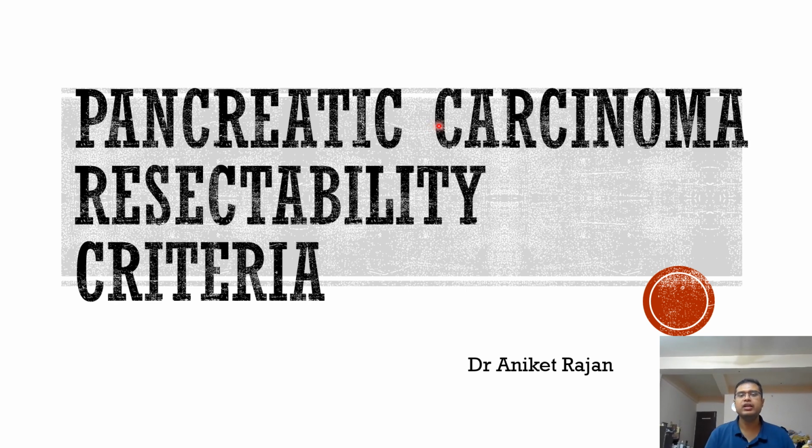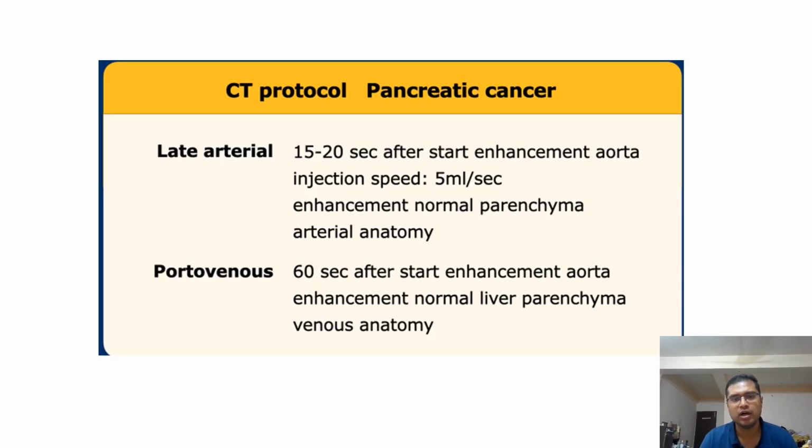So the resectability is usually assessed by the radiologists on a cross-sectional imaging, particularly the contrast enhanced CT scan, and for that we need a protocol, the pancreatic protocol, which includes a late arterial phase and a portovenous phase. So what exactly do we assess in late arterial phase?